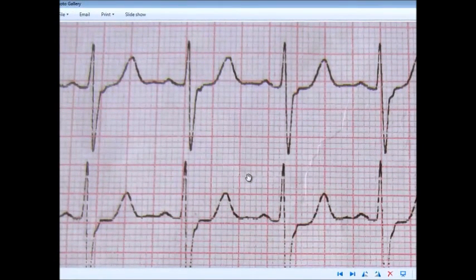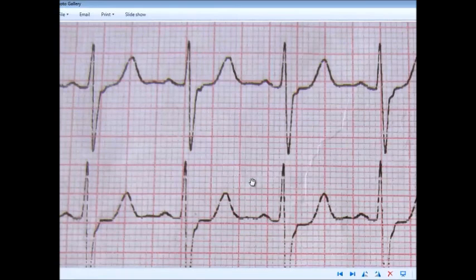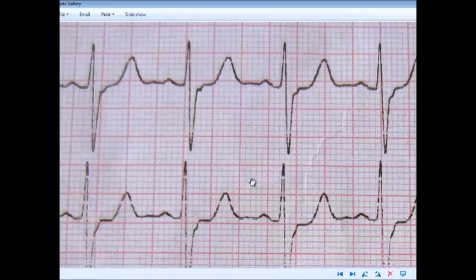Let's work through an example of this method using the same ECG as before. We already have the number of small boxes calculated. We can also express the distance between the two R waves in millimeters, since each small box has a 1 mm length — giving us 18 mm between the two R waves.